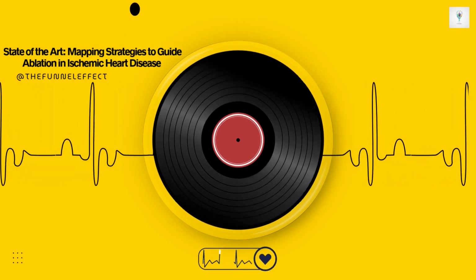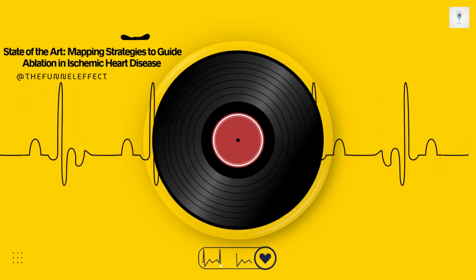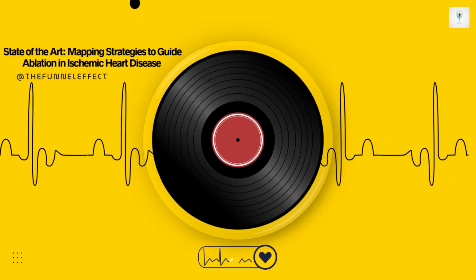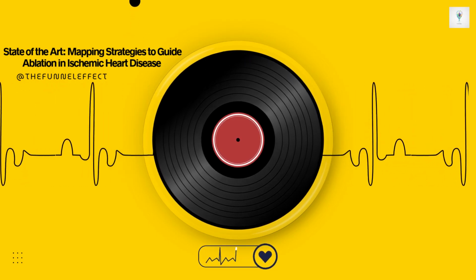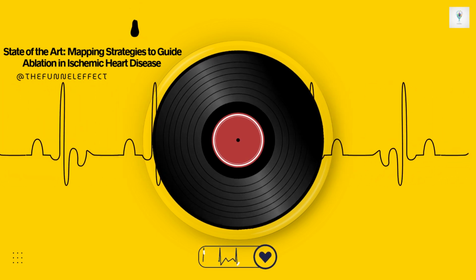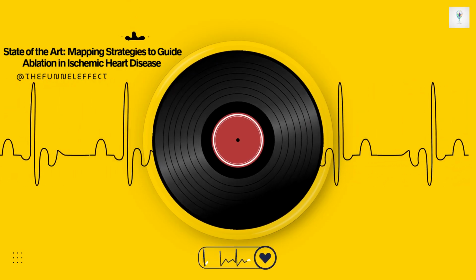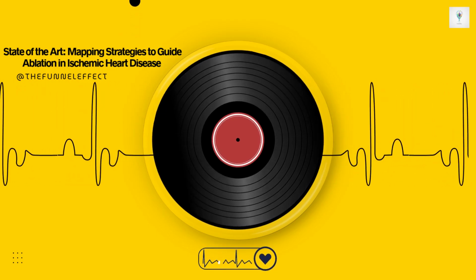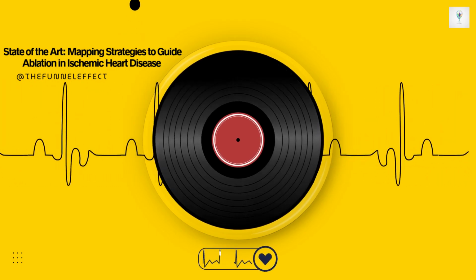You look for diastolic activation. Here's the logic. The main mass of the ventricles activates very rapidly during the QRS complex on the surface ECG. That's systole. But the re-entry circuit, especially the slow-conducting isthmus, has to be activating before that main ventricular activation begins, during the electrical quiet period, diastole. So on the activation map, finding areas where the recorded electrograms occur significantly before the onset of the QRS complex is a strong indicator that you're mapping within the isthmus. The activation of the faster outer loops of the circuit usually happens during the QRS itself. Tracking that sequence, diastolic activation flowing into systolic activation, helps visualize the circulating wavefront.